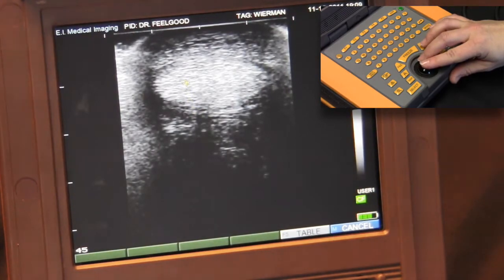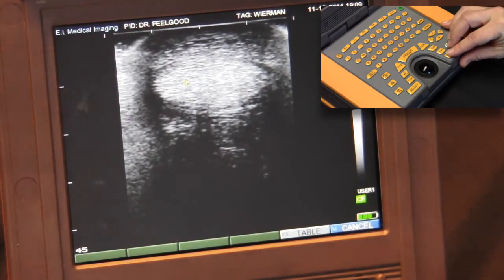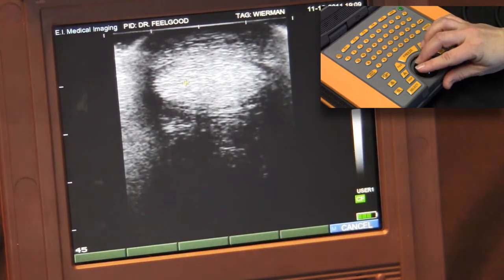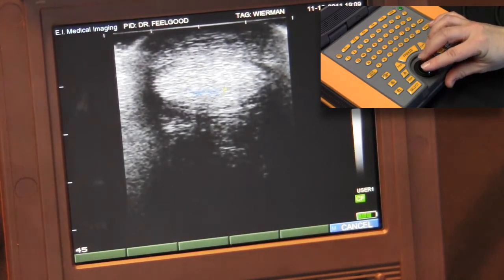Begin your tracing by pressing the select key and use the trackball to outline the defect or structure. When the ends meet, the area calculation will appear.